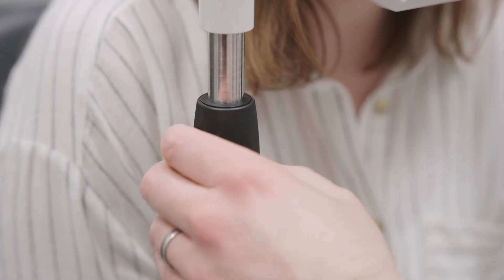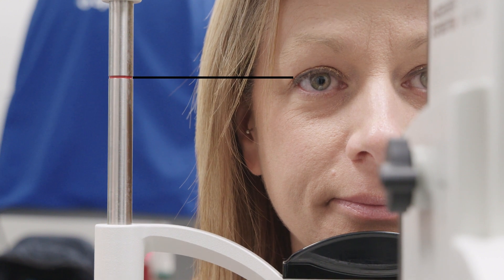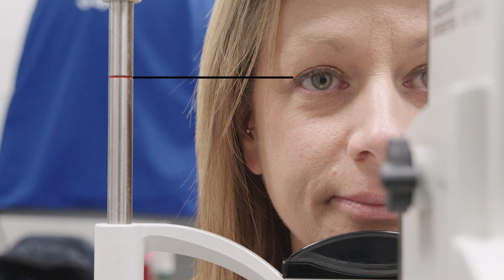The head rest has a red marker to assist with the positioning of the patient's eye. The outer canthus of the eye is best placed just below this marker to give the best range of camera head adjustment.